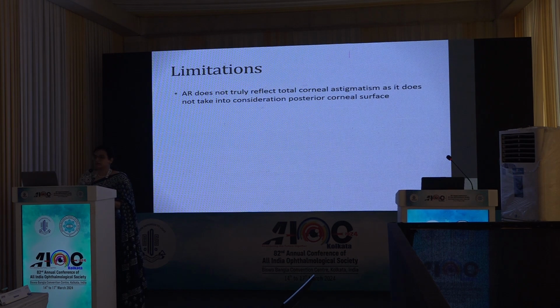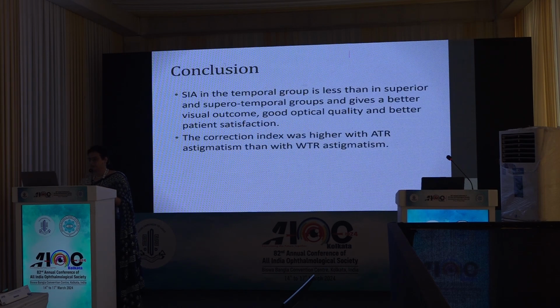The limitations of our study were that it did not reflect the true corneal astigmatism, as the AR machine takes into consideration the total astigmatic power of the eye. Also, it does not consider the posterior corneal surface.